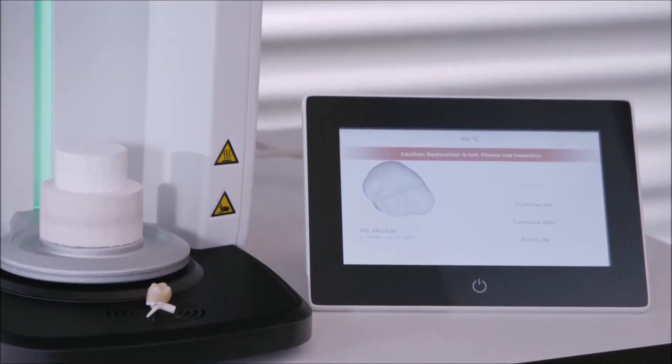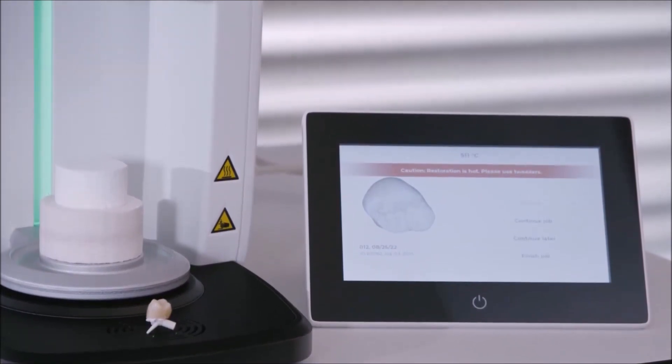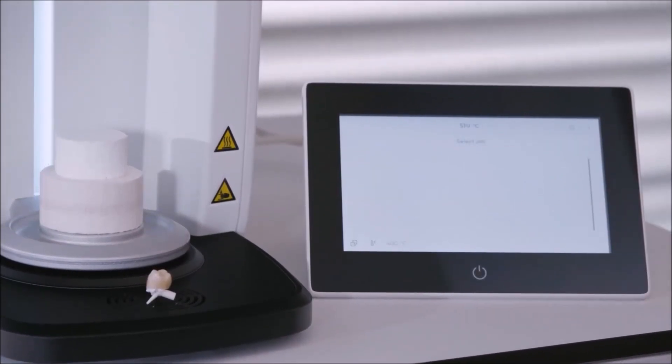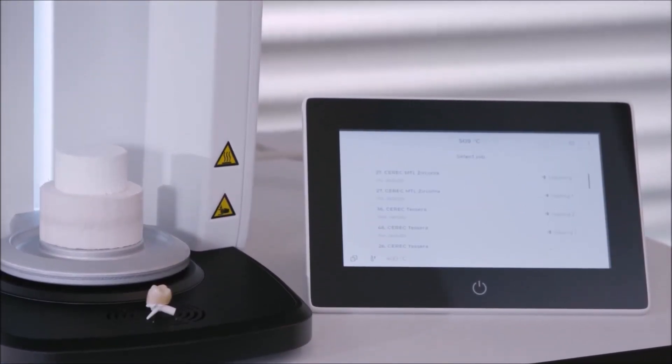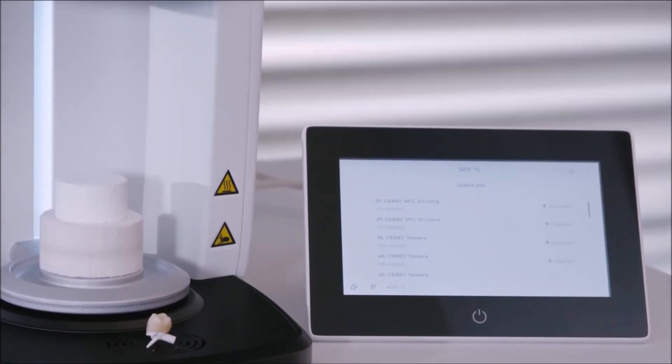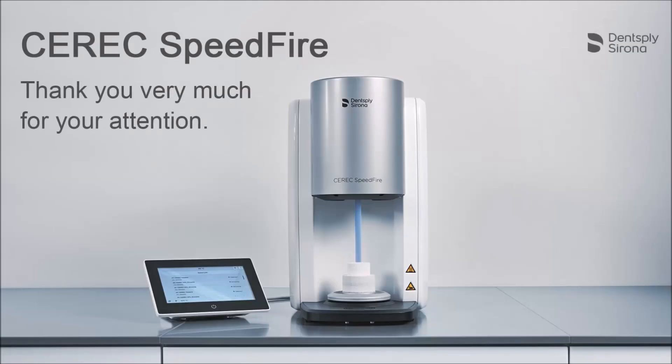It is possible to perform two further glaze firings with this restoration. In this case, we terminate the glazing order with the appropriate button and go back to the home screen. Thank you very much for your attention.